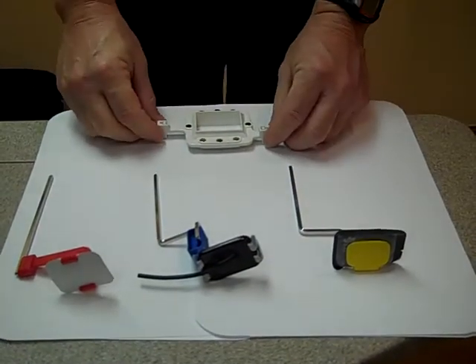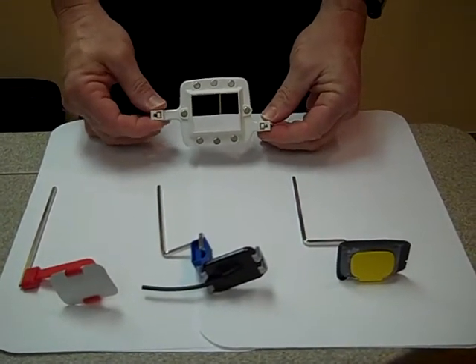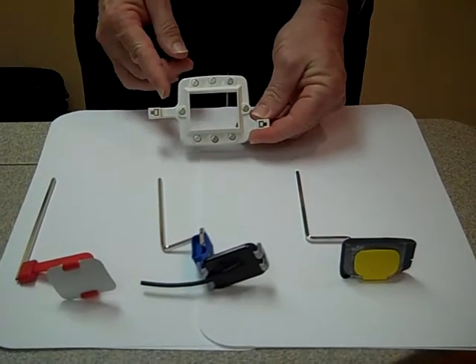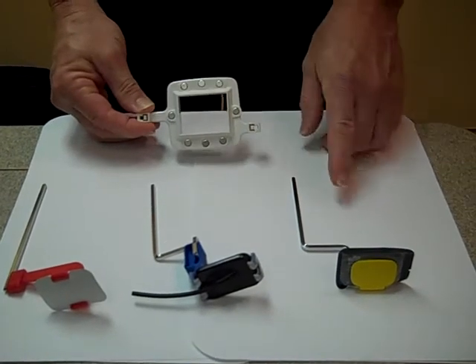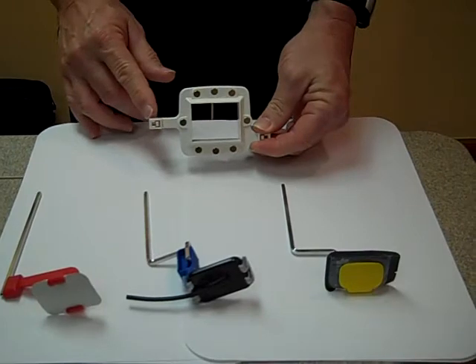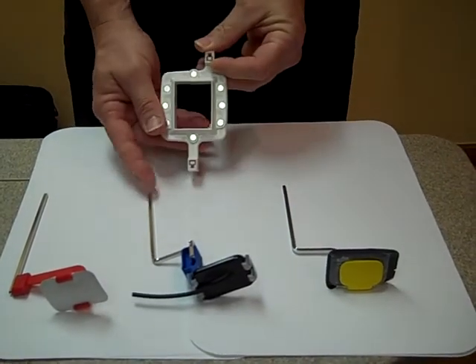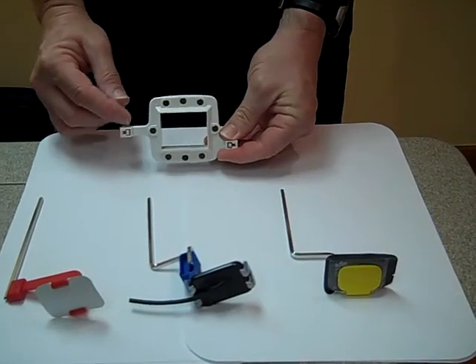We're going to use the TrueAlign ring. If you'll notice on this ring, we have one short arm and one longer arm. The shorter arm is going to be used to take posterior PAs. The longer arm is going to be used to take anterior PAs as well as your bite wing exposures.